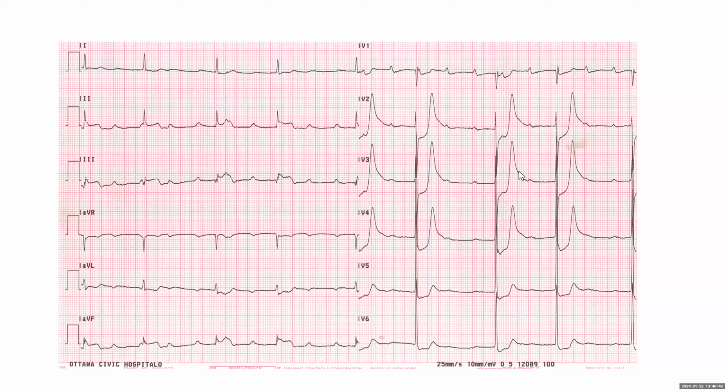So the heart block in RCA, what's the most common? Sultan is saying definitely circumflex. Looks like you're going to do interventional cardiology. Yeah. So the heart block in RCA usually or often is vagally mediated, so you don't get this sinoatrial tachycardia. And then there are the other things, the posterior wall involvement and the aVL sign and so on.